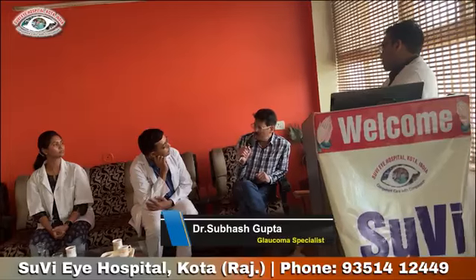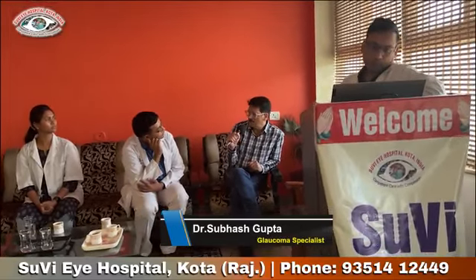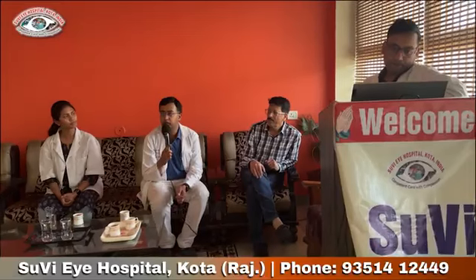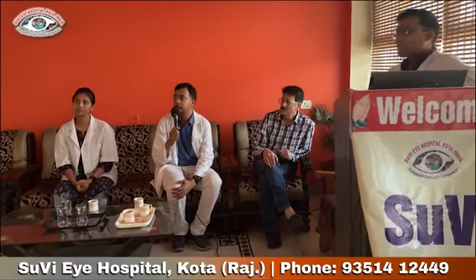Yes, there were some patients who required grid laser sometimes, but nowadays it is very less. Only for non-center DME, where there is a microaneurysm, focal laser is used. Grid laser nowadays, as I mentioned, is very less. Sometimes focal.